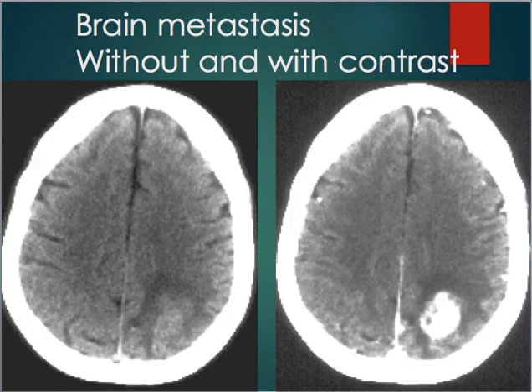Again, this patient has a brain metastasis. Without contrast, you can see something's going on. You can see the fluid. You can see a little bit of the tumor here. But with contrast, what a difference it is. It highlights it, lights it up, and you can visualize it much better.